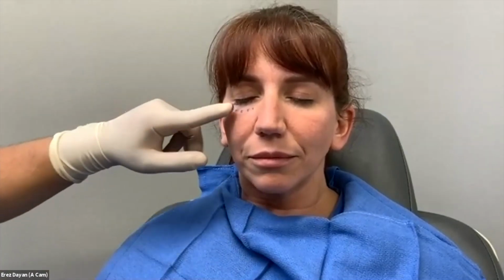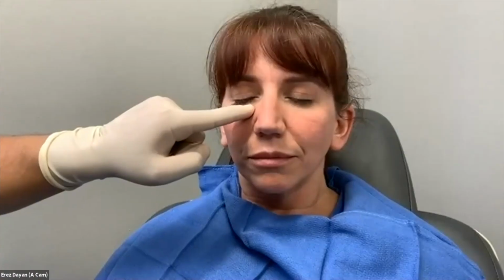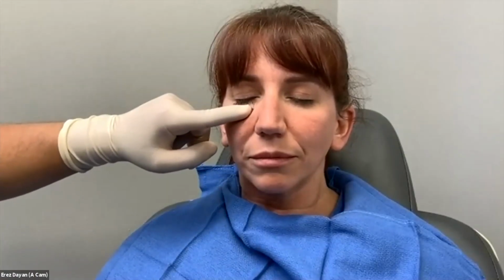So that's lower lid. The thing to be cognizant of is you always want to make sure your internal cannula is deep, and you can get superficial here because you're going over a curved area. So just make sure your internal cannula is always on the periosteum. Put enough tumescent in so that it's really kind of blown up, so you really define that space and you're totally safe. For the nasolabial area, I'm going to show you how to do it.